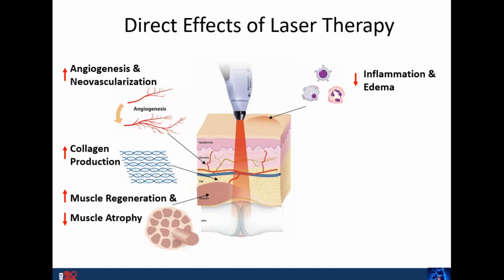Of course, inflammation and swelling is an important feature of disc herniations. And I'm going to talk a bit more about the systemic effects on inflammation and how that might help disc herniations. Nerve regeneration: if there's compression directly on a nerve, then we know that photobiomodulation helps with the repair of neurons, especially remyelination or repair of myelination with respect to Schwann cell activation or repair process.